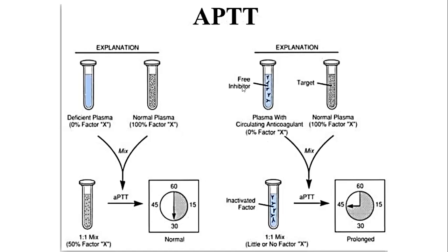So, how do we confirm if may inhibitor against clotting factor 10 ang samples ng pasyente? We get another sample, right? Separate na sample, kung magado ka-control naton. We get a sample which has clotting factor 10. Okay?